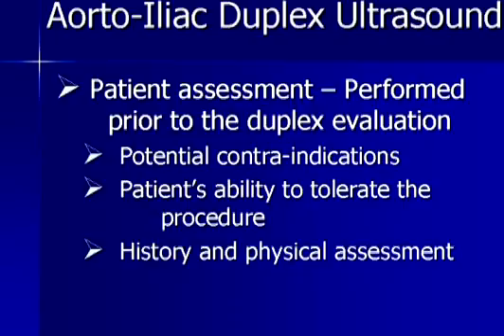The assessment of the patient will be performed prior to actually initiating duplex evaluation. You want to establish that there are no significant contraindications to the study, or if there are relative contraindications, you have taken those into account in planning your study protocol. You need to take into account, particularly in those patients who have had recent abdominal surgery, their ability to tolerate the entire duration of the procedure. And again, you may need to adapt your specific protocol to that.